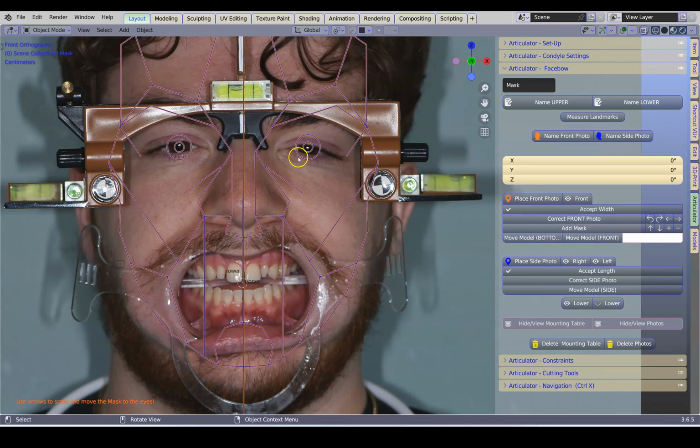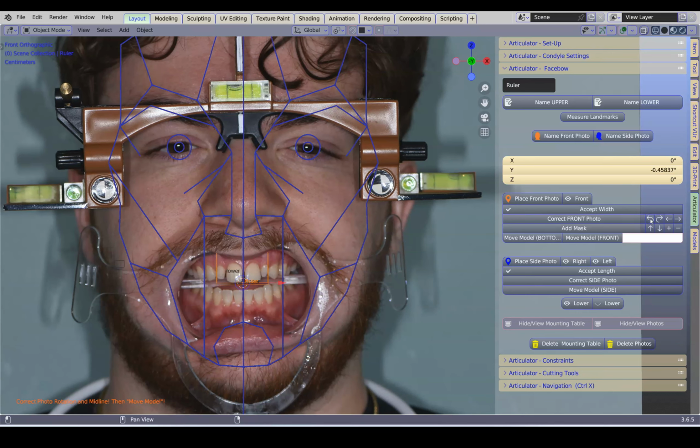Okay, here you can see that eye is hanging down a little bit, which confirms the bubble. So this is arbitrary, but if we bring it to the alignment of the pupils, this bubble would be rectified, but it doesn't look it because this is going uphill.